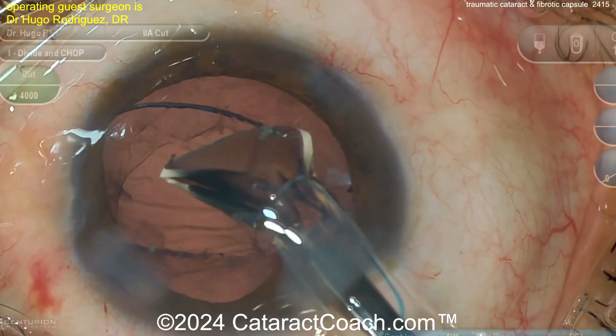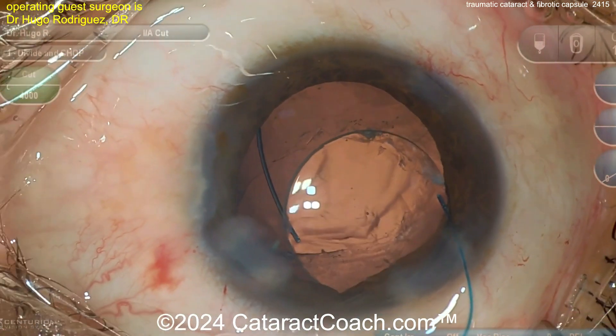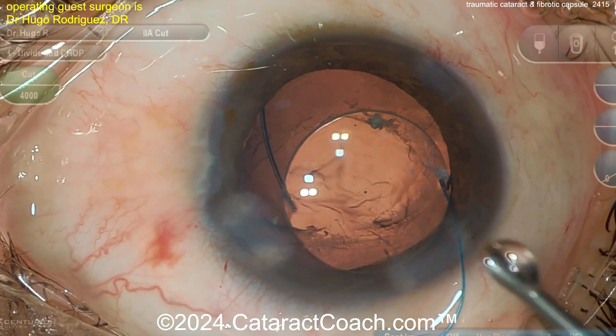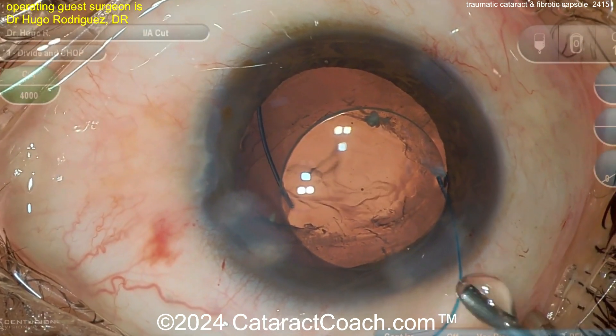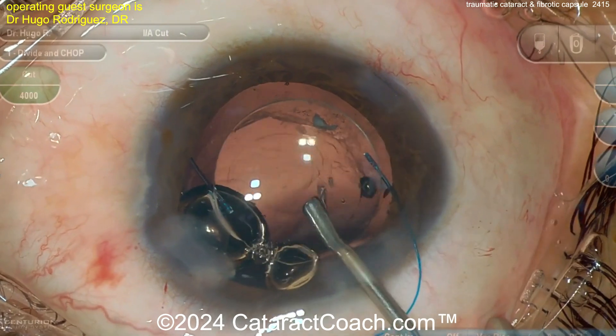Going on top of the hours — okay, I like that. Open up the optic here, get it turned correctly. Wait — that is upside down! That lens is upside down, you better flip that thing over. Look at the haptics in the S-formation. S, as you know, stands for 'stupid' — I don't want to be stupid, I want to be smart. More viscoelastic going inside.